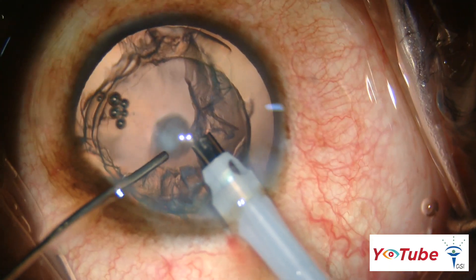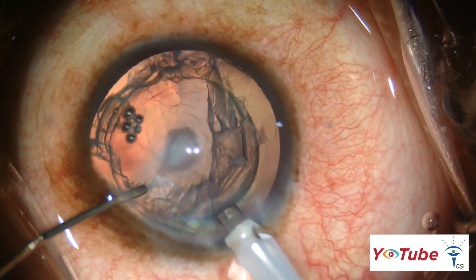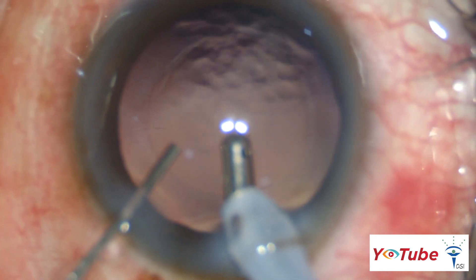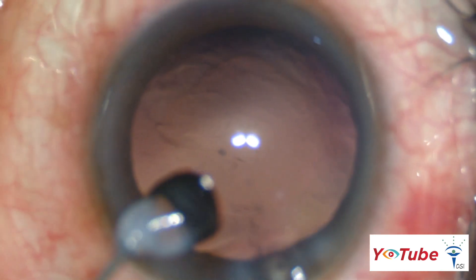An important caveat is to inject viscoelastic from the side port whenever the phaco or irrigation-aspiration probe is withdrawn from the eye. This helps to keep the anterior chamber well formed and prevents forward bulging of the posterior capsule throughout the surgery. Major fluctuations in the anterior chamber should be avoided.